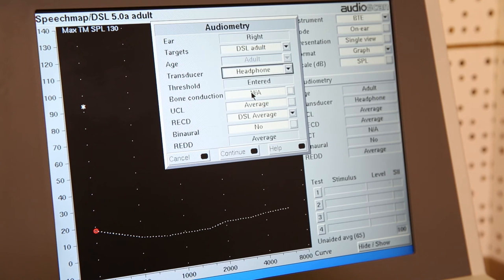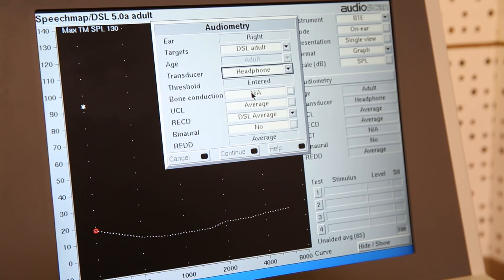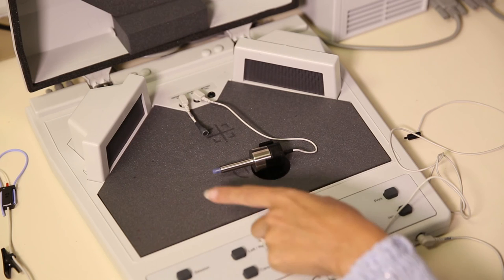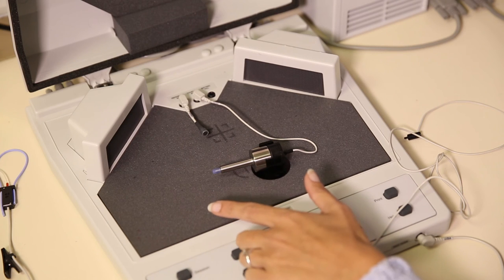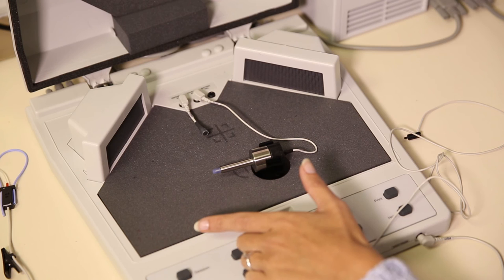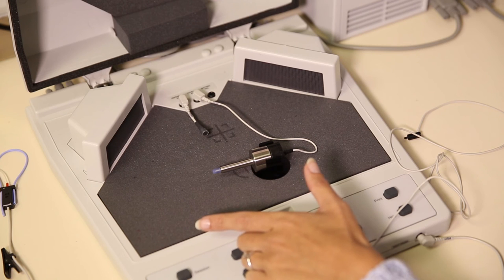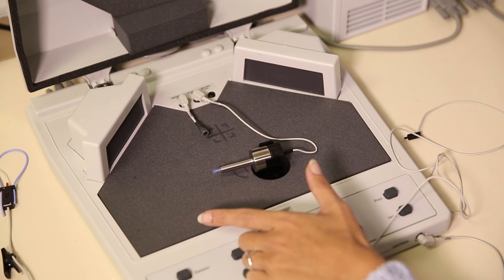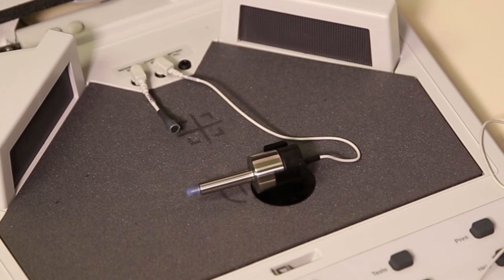You then need to think about where the sound is going. When we program a hearing aid, the software uses a 2cc coupler as an estimate of the size of the average ear canal to create a target. But we know that a smaller ear canal space naturally provides additional amplification, and so would require less gain.